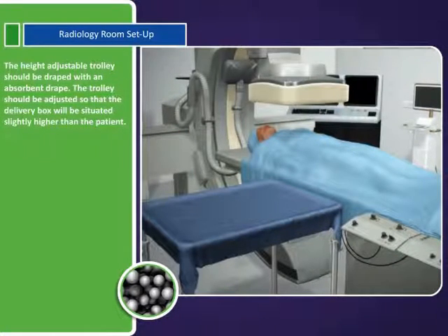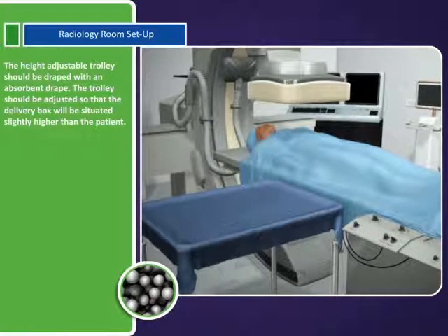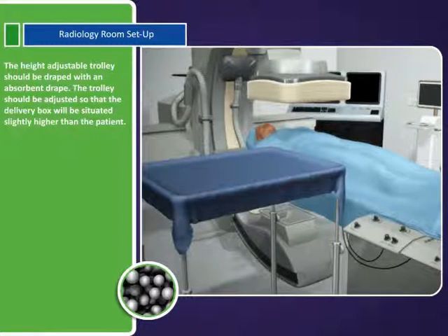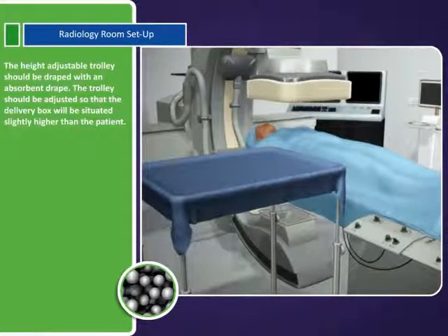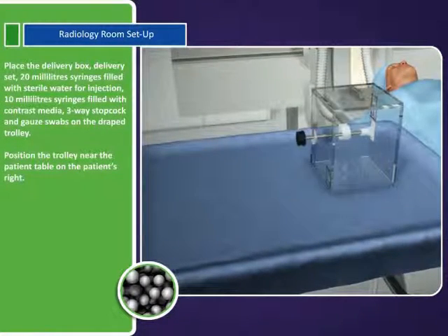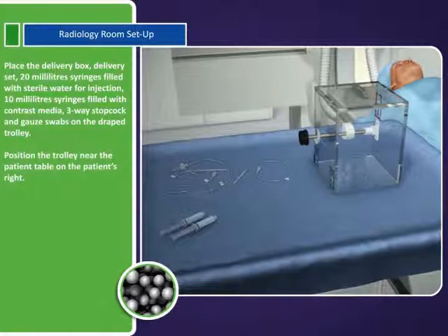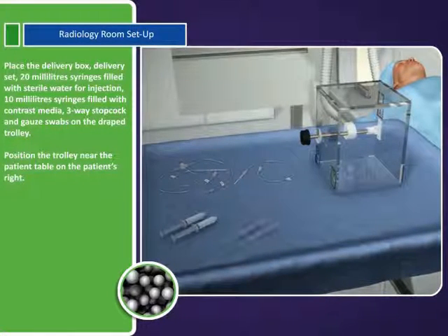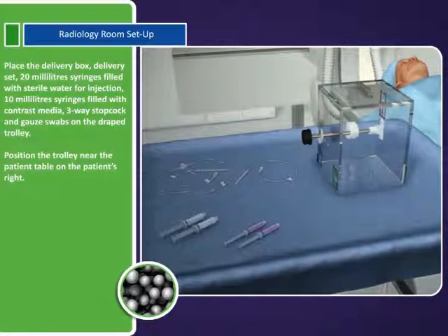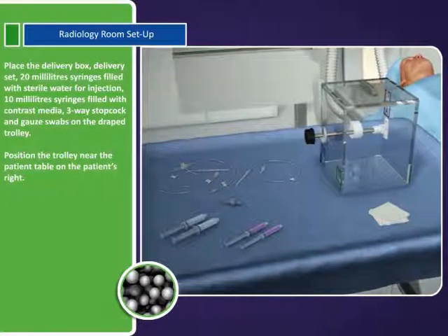The height-adjustable trolley should be draped with an absorbent drape. The trolley should be adjusted so that the delivery box will be situated slightly higher than the patient. Place the delivery box, delivery set, 20-milliliter syringes filled with sterile water for injection, 10-milliliter syringes filled with contrast media, three-way stopcock, and gauze swabs on the draped trolley.